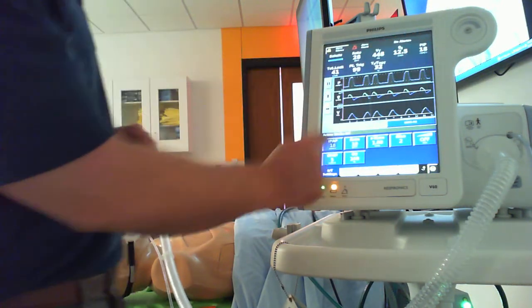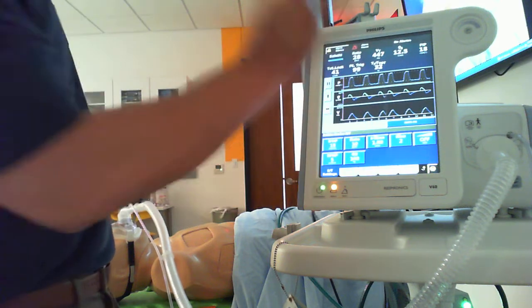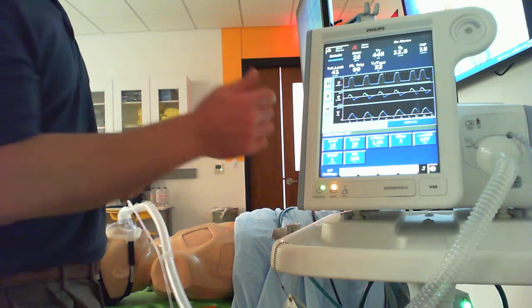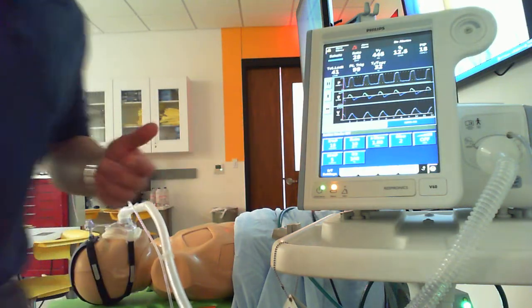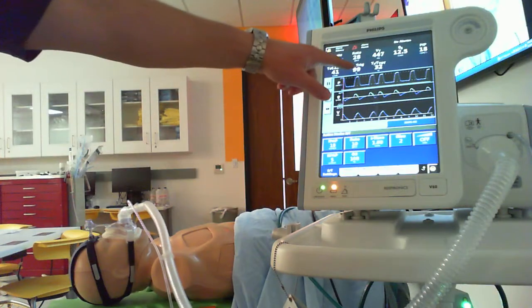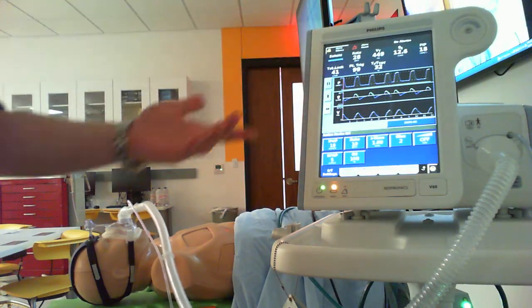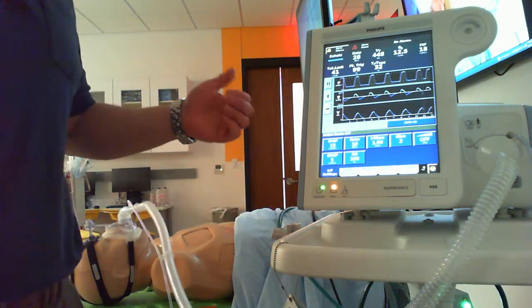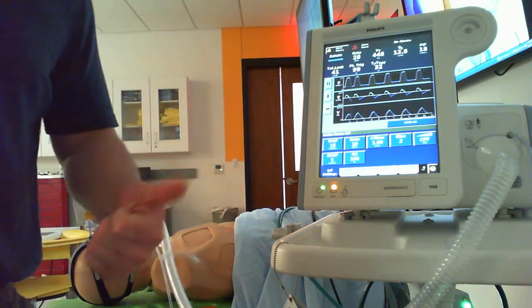We are reaching our peak inspiratory pressure here, so 18 and 18, so we're good. Total leak is acceptable, 40, okay. We don't want that too tight, you want a leak. Patient trigger. He might have got a couple of timed breaths while I'm manipulating it and everything, but this is just how many of the breaths the patient's triggered. Ideally, that'd be 100%. As that starts getting further and further away from 100, all right, we worry, is there leaks going on and the patient's having trouble triggering?